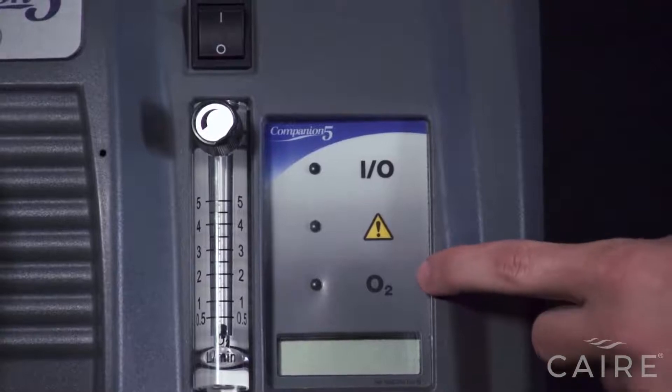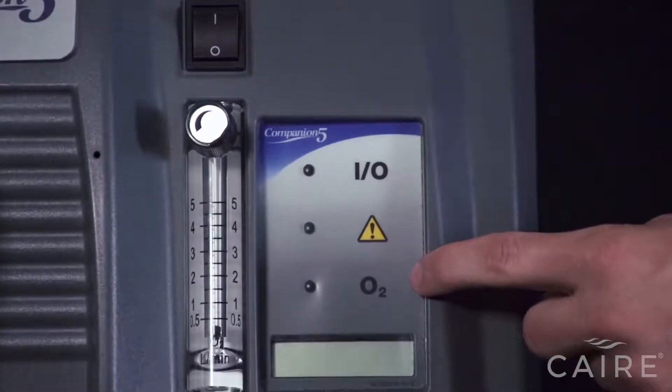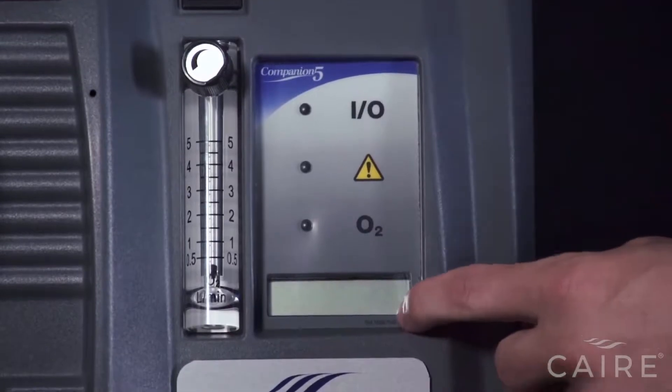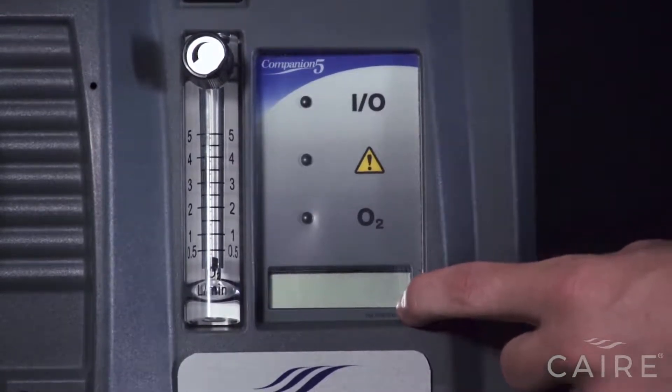This bottom light is optional — your machine may or may not have this — but this is an oxygen monitor alarm that will light up yellow if the oxygen percentage drops below an acceptable level. And finally, down here is the hour meter, which also displays diagnostic alarm codes if there is an alarm condition on the machine.